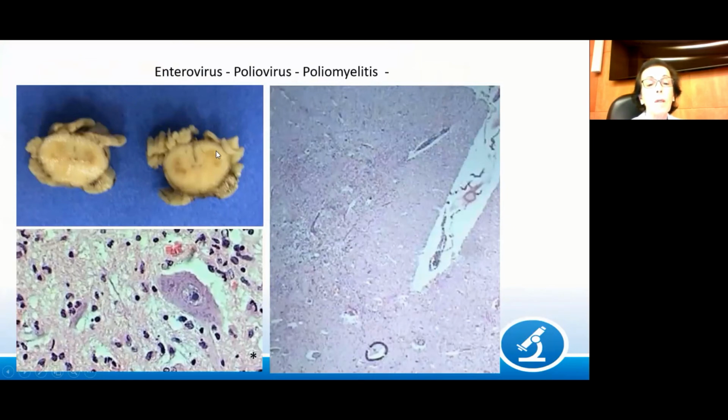You see that just the anterior horns of this spinal cord are damaged. So this is a poliomyelitis. Polio, because it's just the gray matter. Histologically, there is a lesion here, inflammation and softening of this anterior horn. Getting closer, we just see one remaining motor neuron because all the others have gone.